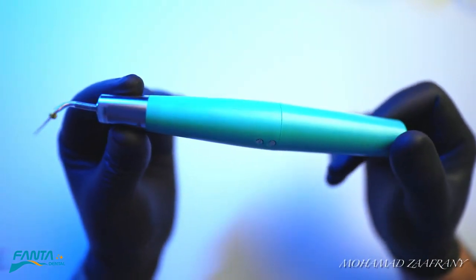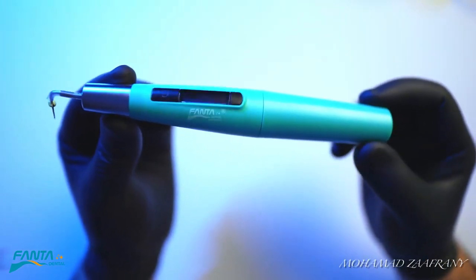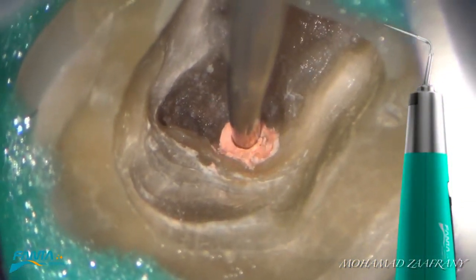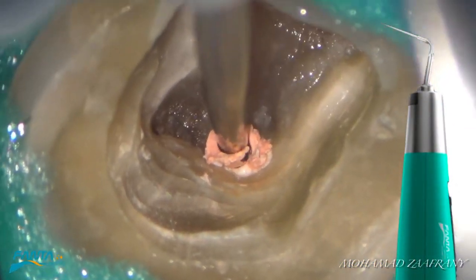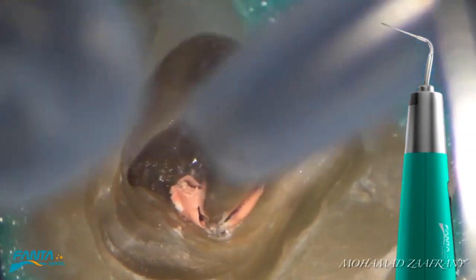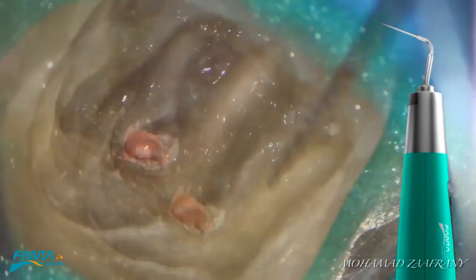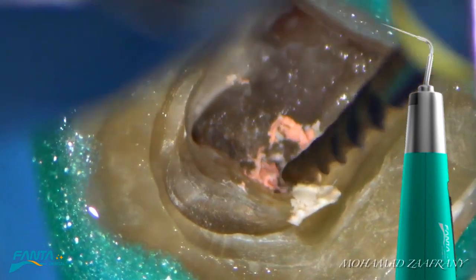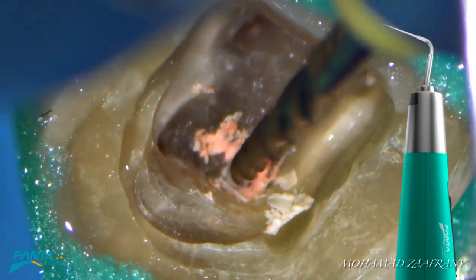Let's show the clinical applications of the E-Heater. We can use it to melt gutta-percha in the coronal portion in cases of retreatment, to facilitate engagement and deep penetration of mechanical files to remove the old gutta-percha.